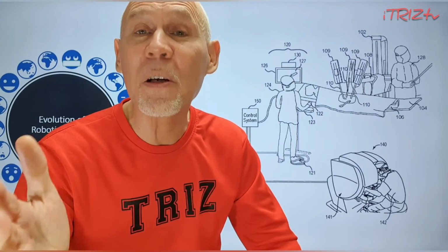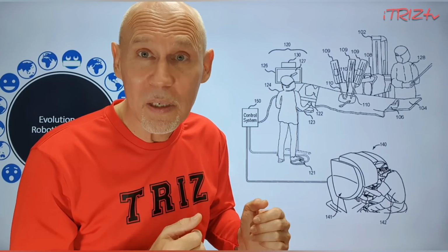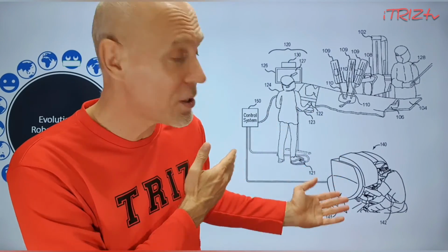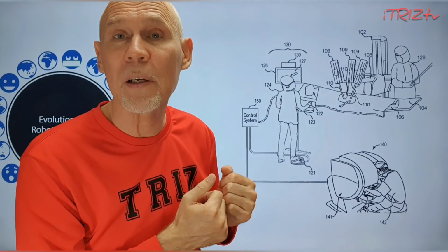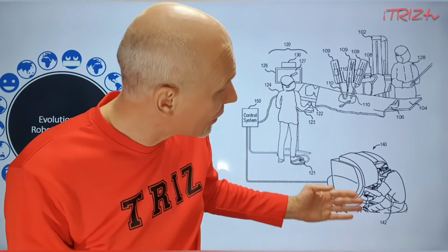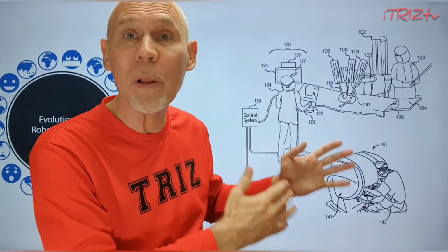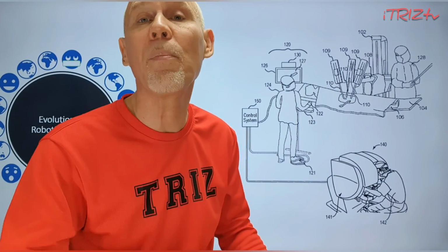And there is an intermediate step where we can see robotic surgical systems, and at this particular stage the human is usually displaced from manual operations, but he or she is attracted into supervision and control. And I think that we will continue seeing human operators taking the most important decisions during robotic operations.